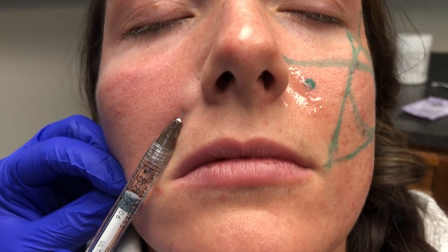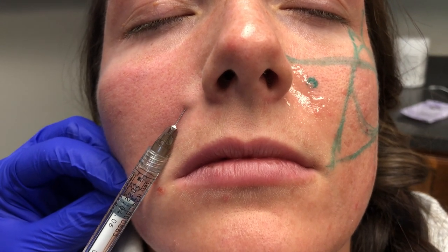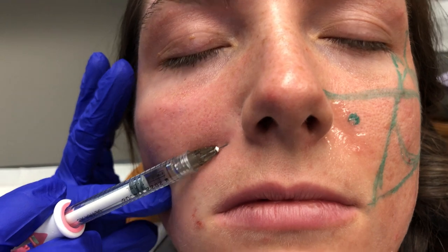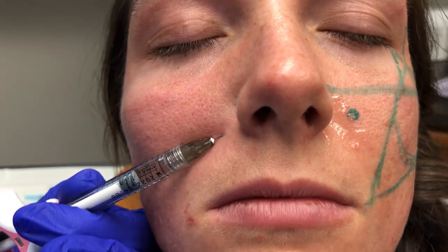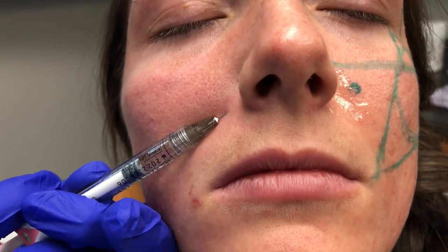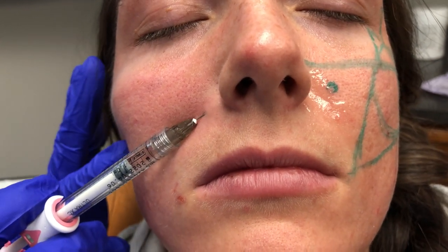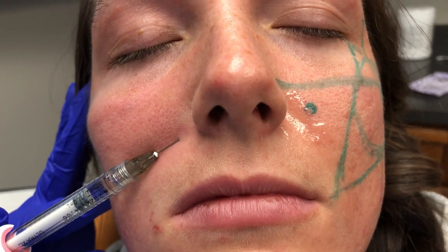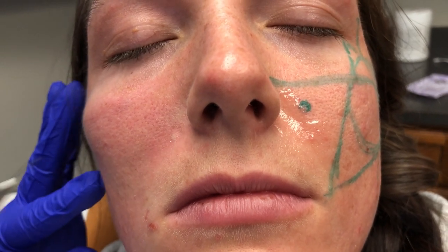With all of this treatment, you can see how the WAVE-FE ultrasound imaging can change the entire dynamic and make you a much safer injector. It's quick, it's affordable, it's the best on the market, and you'll be able to use it for the best safe injections. And as always, it's time for you to get AFI certification trained today.